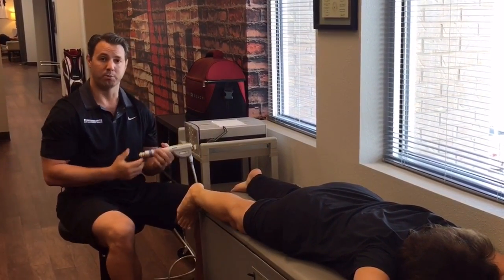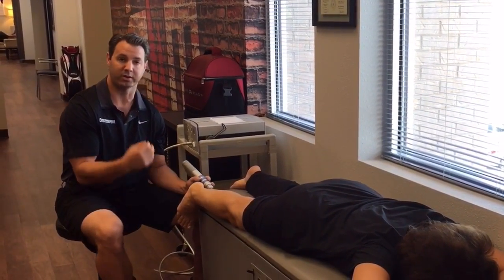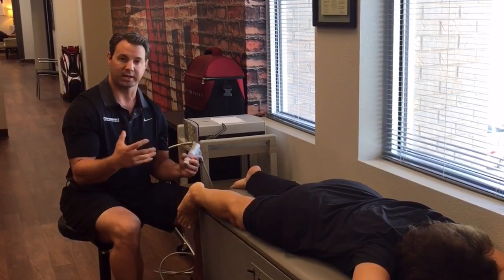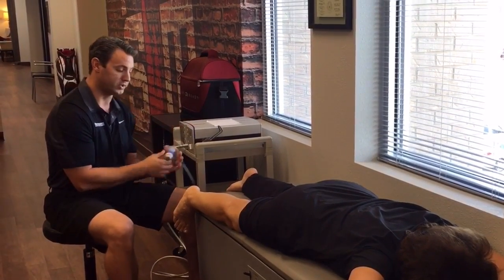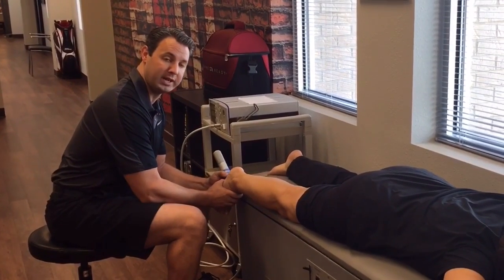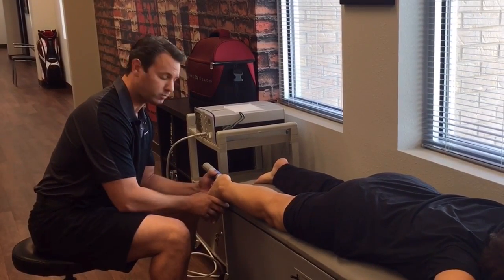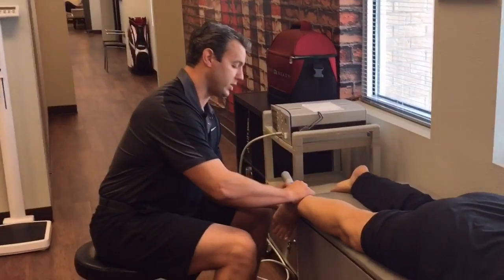The most efficient way to break that up is with extracorporeal shockwave therapy, which produces pulses to break that down at a drastically accelerated rate, besides just rolling a golf ball on there or using thumbs — even though that is effective, this greatly accelerates how fast you heal. All we do is use a series of air pulses right on that foot, working the whole plantar portion of the foot, breaking up the scar tissue, creating blood flow, and sitting right on that knot to break that scar tissue up. Usually this treatment takes about three to four minutes and we treat the entire foot.